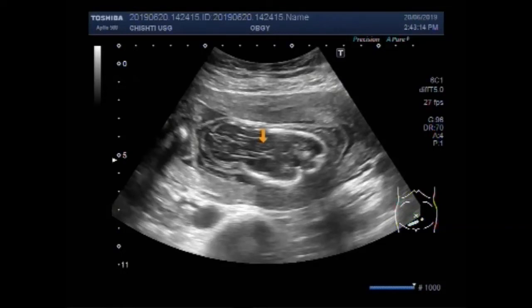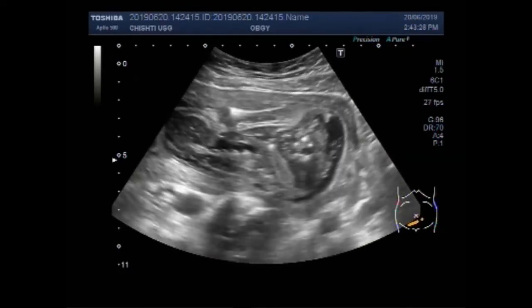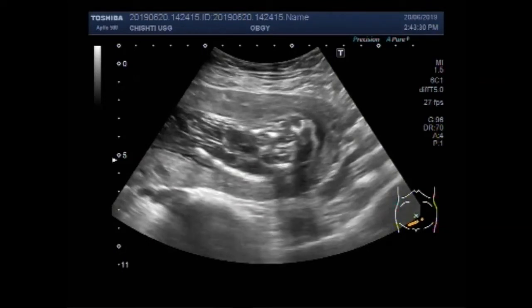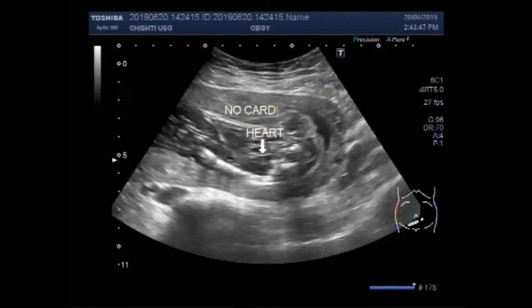This is the abdomen of the fetus. You can see the fetal chest cavity. This is the heart and there is no fetal cardiac activity — no cardiac activity is seen, visible, or audible.